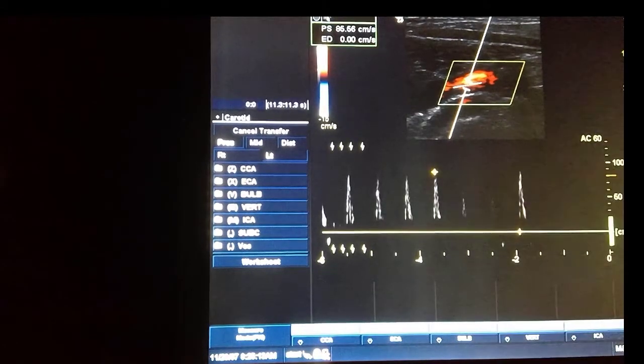There it is. That's the blood flow that the machine has been told to create. So now we have really messed up what that subclavian looks like. It looks like there's disease possibly happening. We're not getting the right information. So again, it proves just how important it's going to be that you check your settings for every picture, you adjust them, you make them appropriate for what we are seeing.